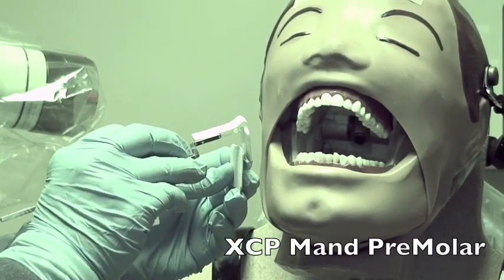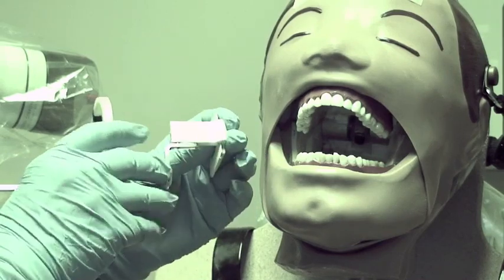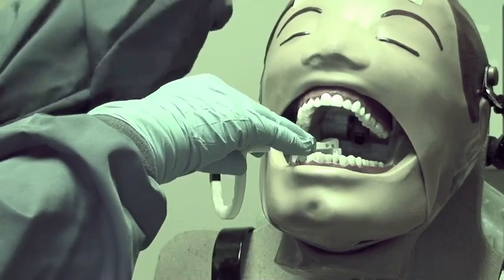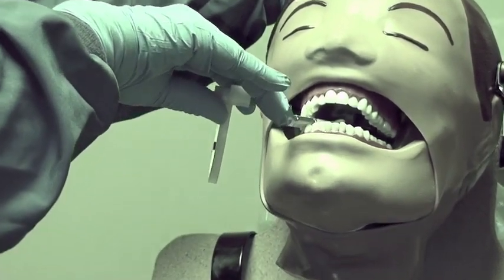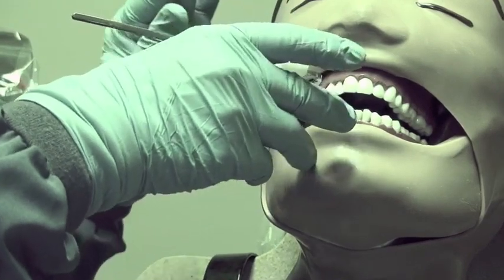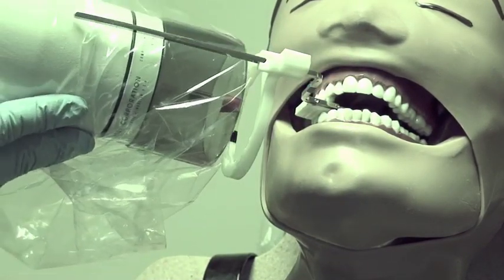Now we're going to do the mandibular molars and premolars. Again, dot goes in the slot. Come across the arch for the premolar — opposite lateral canine. As the person closes, center the ring over the premolar teeth. Then line up your PID to be parallel to the ring.